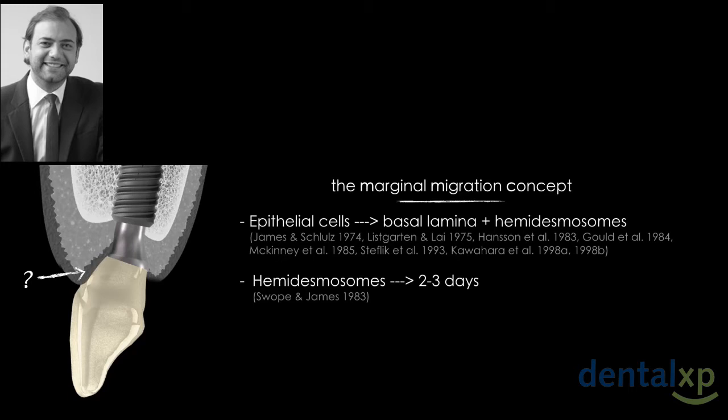Most of the people, not all the people, we saw that yesterday in Grunder's lecture, but most of the people, they urge us to support immediately this portion of soft tissue. Well, this works when we're dealing with thick tissue biotypes. This also works when we're dealing with thinner tissue biotypes, but we also graft soft tissue.